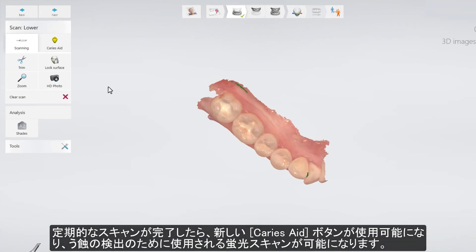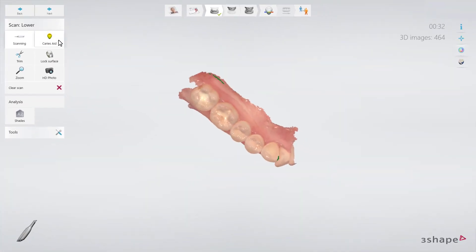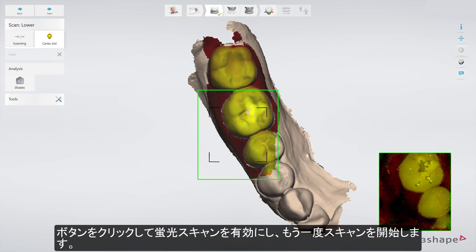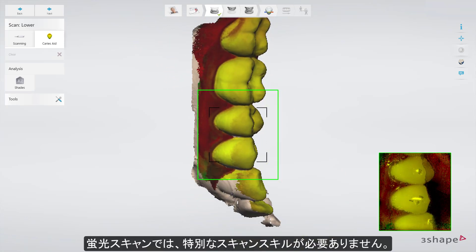When the regular scanning is finished, the new Caries Aid button becomes available, enabling Fluorescence Scanning for aiding the detection of possible surface caries. Press the button to activate Fluorescence Scanning and start scanning once again. Fluorescence Scanning requires no additional scanning skills.